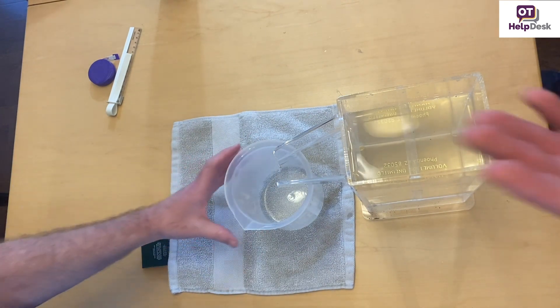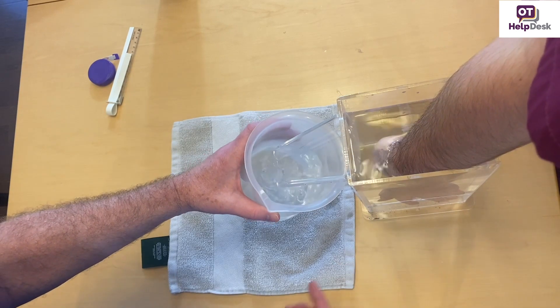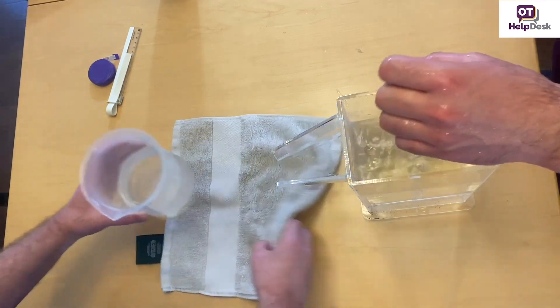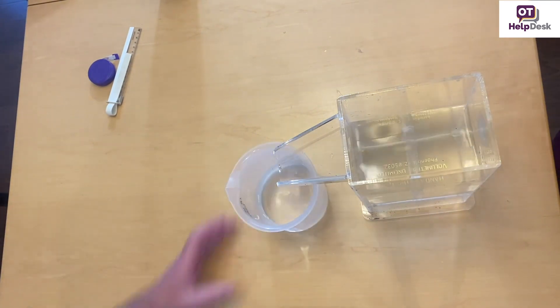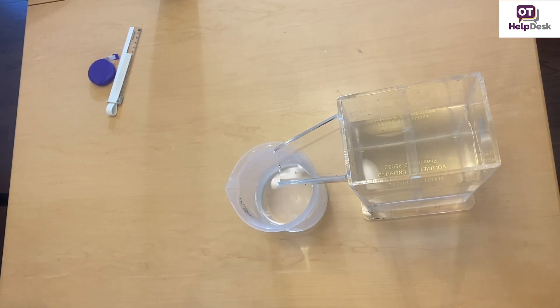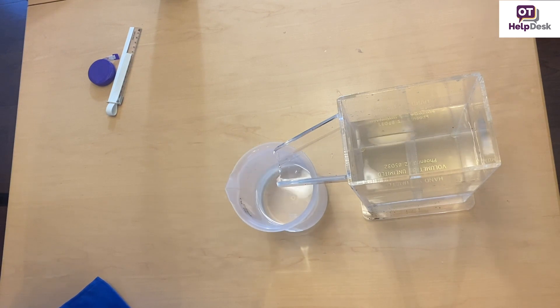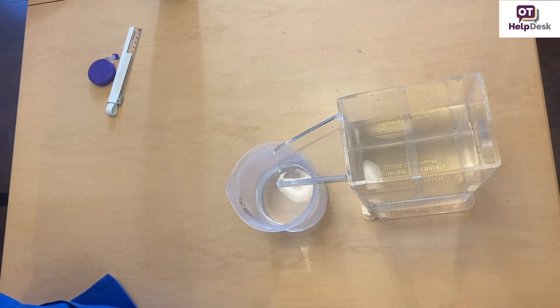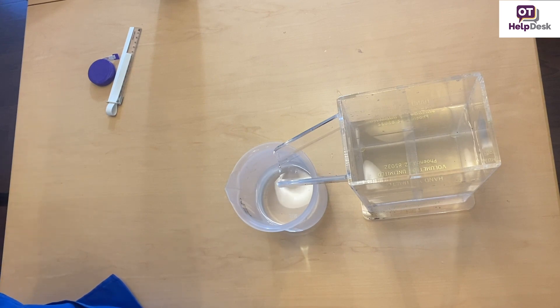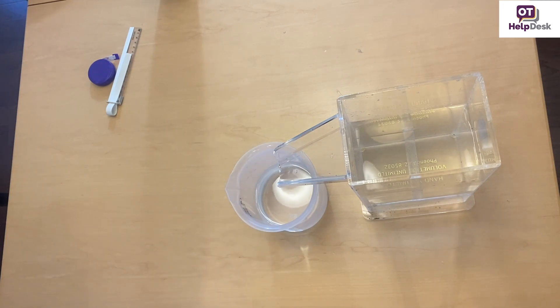Joseph, now you're going to do your other hand the same way. Put it down in — perfect. He's in the area where he should be; hold on until it empties out all the way. Now I'm going to do the measurement. Interestingly enough, the difference between Joseph's right and his left is about five milliliters. That's enough to note the difference. Why would that be? Because of hand dominance in most cases, and we're only going mid shaft of the forearm. So now I know what the right is versus the left — not a huge difference.